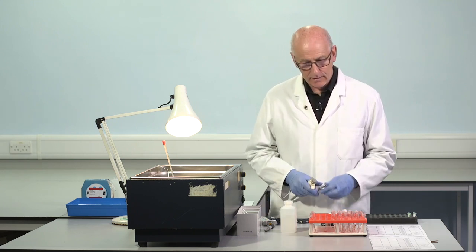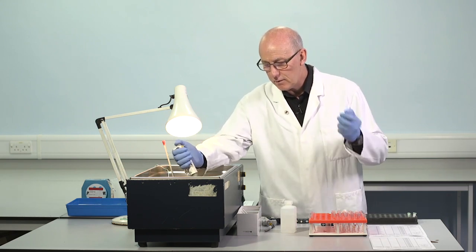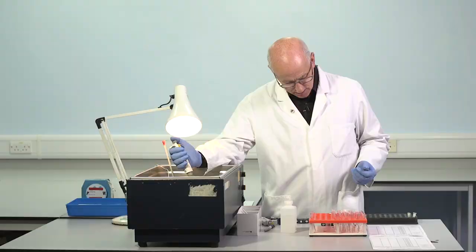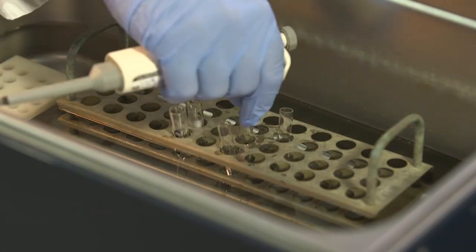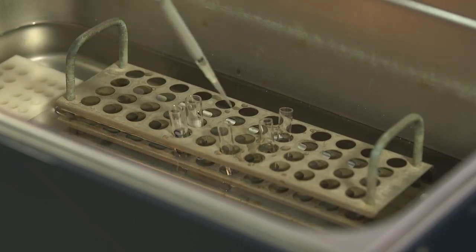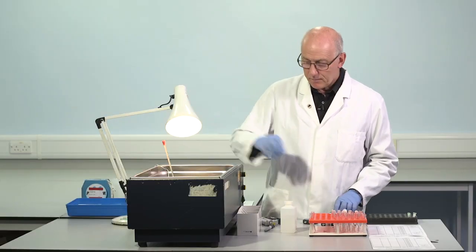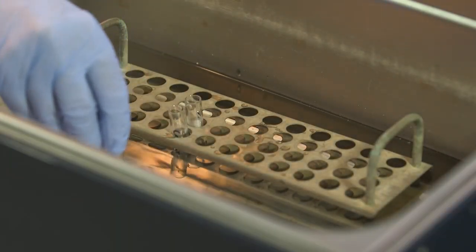So, 3-minute activation. Calcium to the first tube, start a stopwatch. 15 seconds, calcium to the second tube, start a stopwatch. 30 seconds, calcium to the third tube, start a stopwatch. Now we need to observe these mixtures for clot formation.